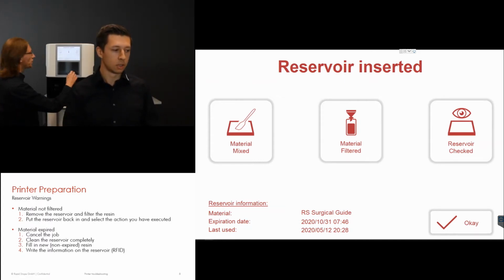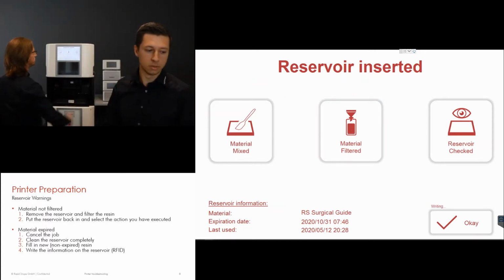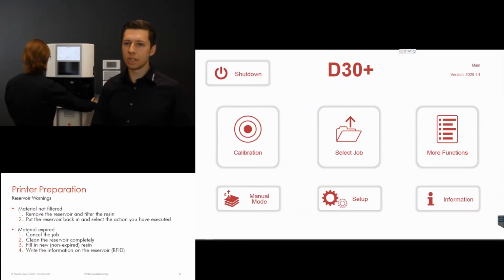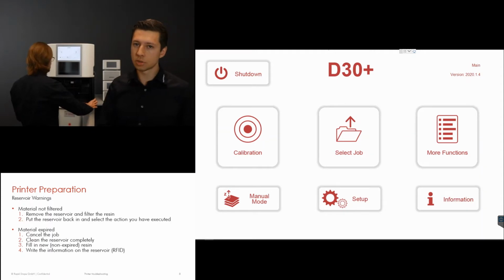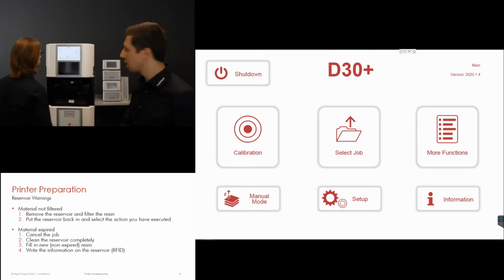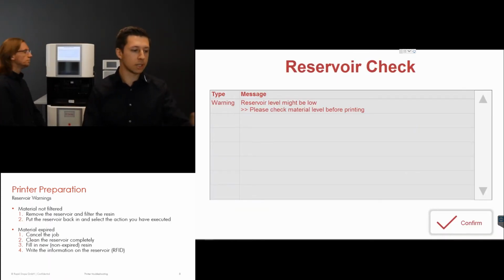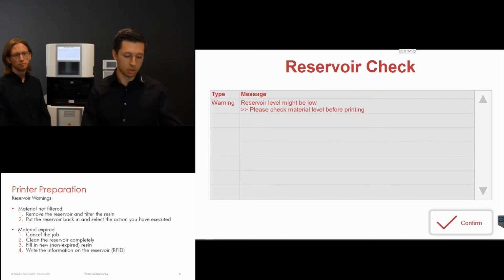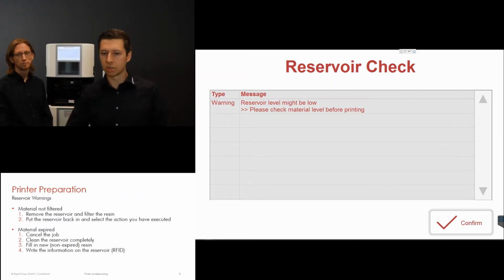Okay, let me do this. Exactly. So Robert has filtered it, that's good. So now to check if really everything has worked out so far, we will just reinsert the reservoir and have a look at the warnings again. Okay, looks good, only the reservoir level might be low, which we solve later. So that's all about the reservoir warnings.